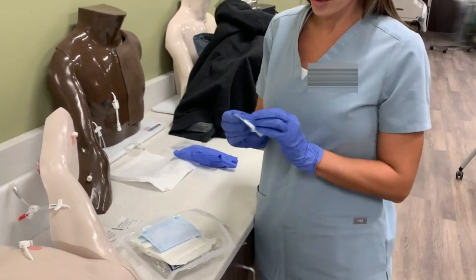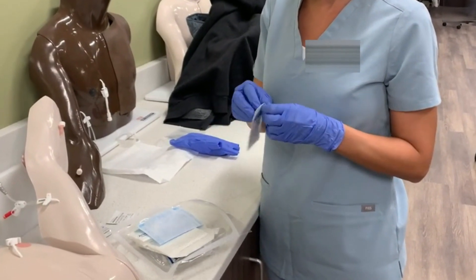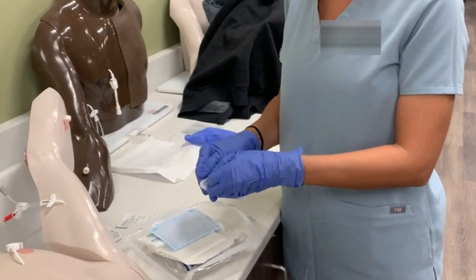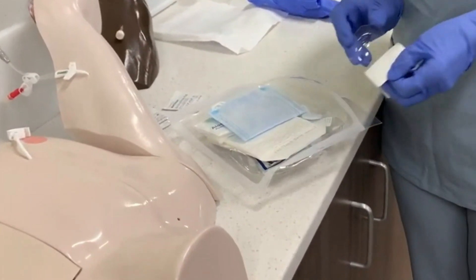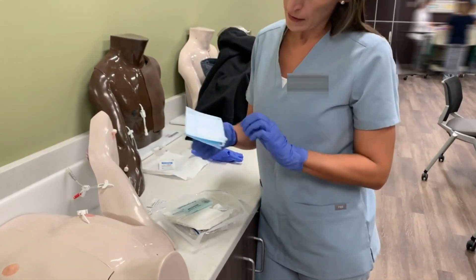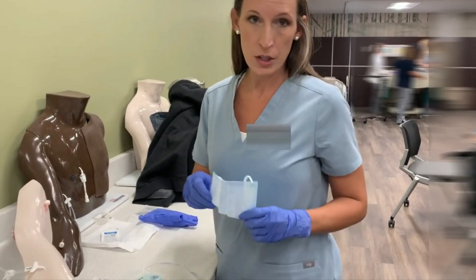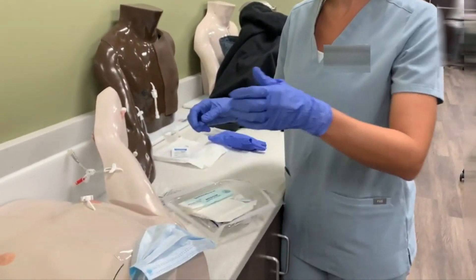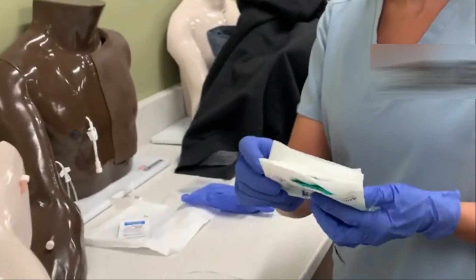Take your bio patch, open it, and drop it inside your sterile package without touching it. This kit has a mask — if it has a mask and you're doing a central line dressing change, you'll want to put it on the patient. Usually you'll put one on yourself too. Then you have your sterile gloves, and you'll put those on.